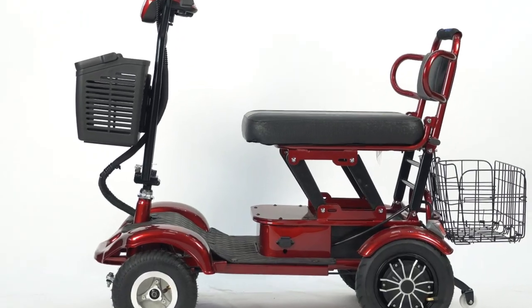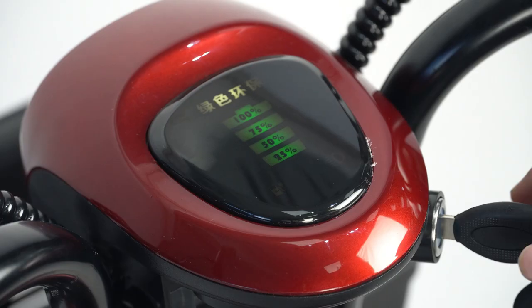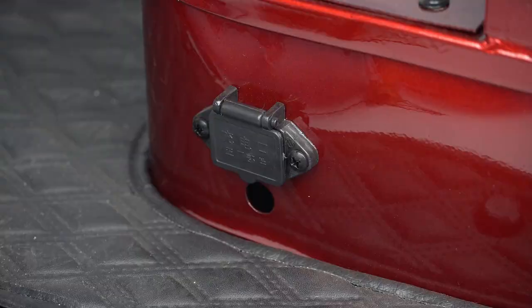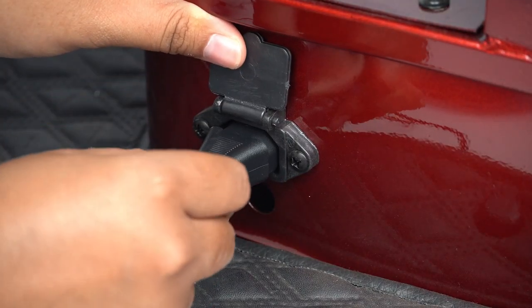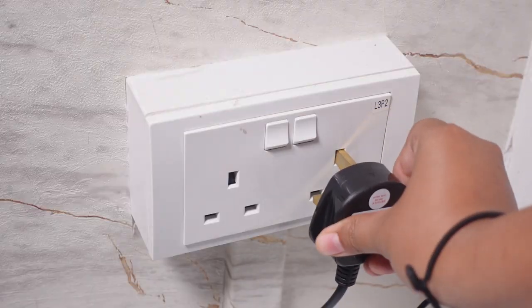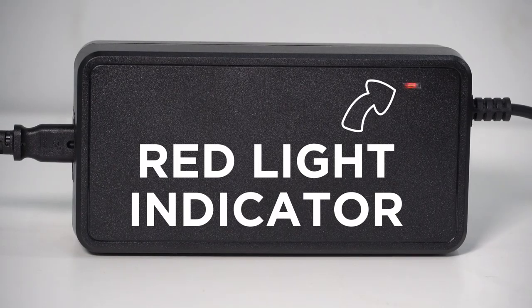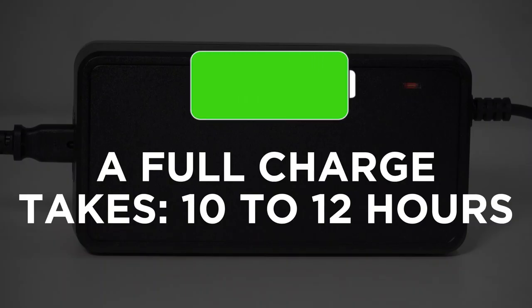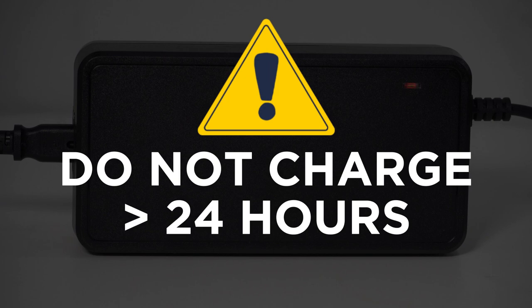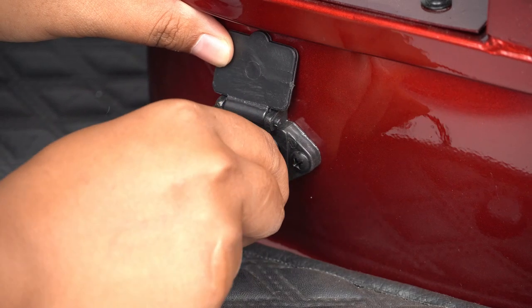Charging: The charging port is on the left side of the scooter, below the chair. Before charging, make sure that the power is off. Remove the protective cap and connect the charging cable. Switch on the power supply. A red light indicator will appear on the power brick. A full charge will take 10 to 12 hours. Do not overcharge the device for more than 24 hours. Remove the plug when charging is completed.